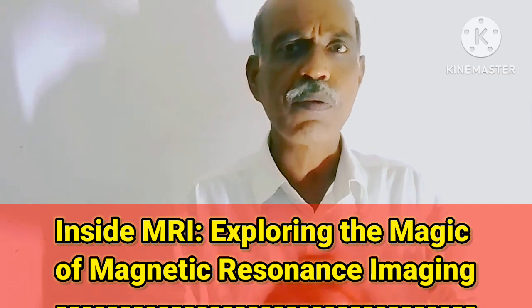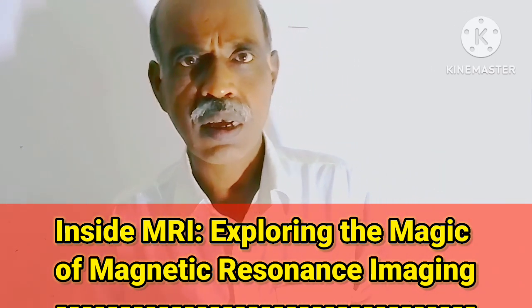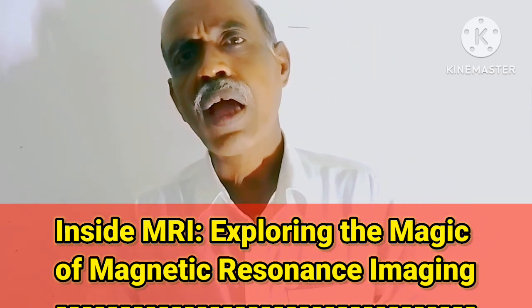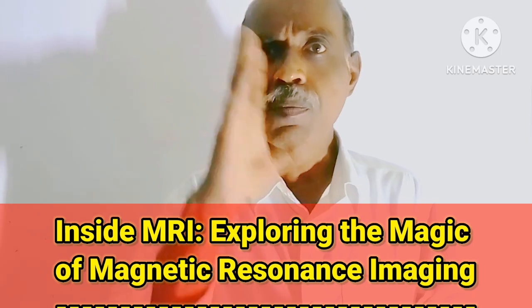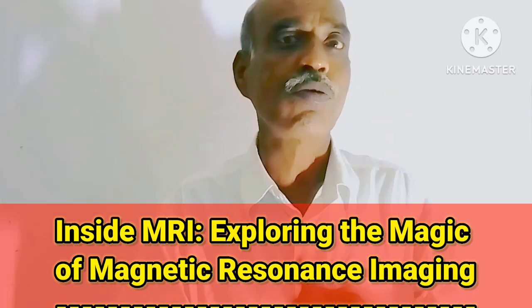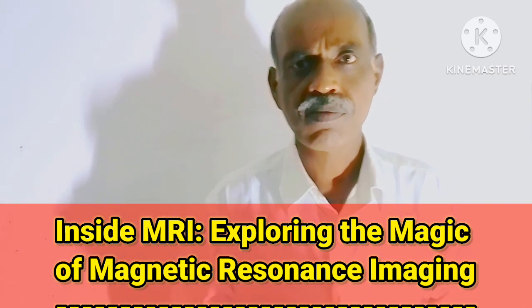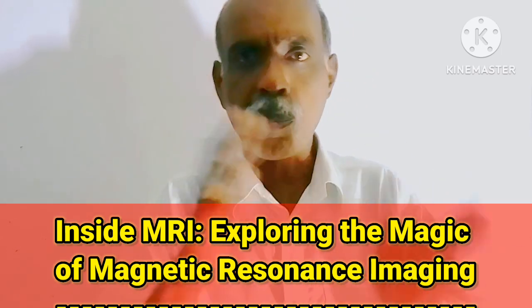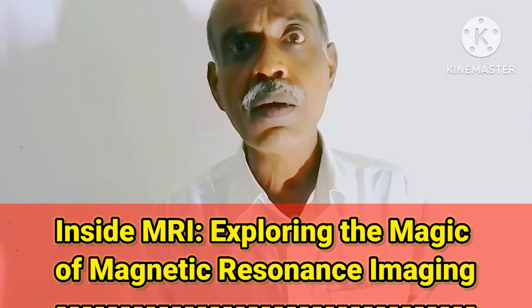So there is an abundance of hydrogen atoms in the human body, and in most cases we are talking about water. Hydrogen atoms have only one proton in the nucleus, and these protons have some spin.